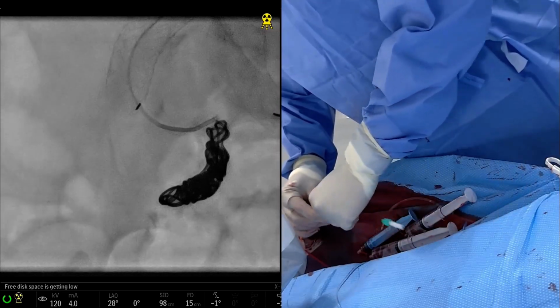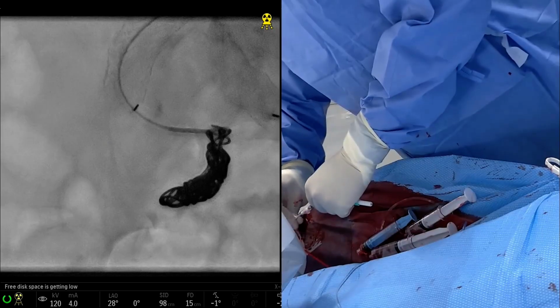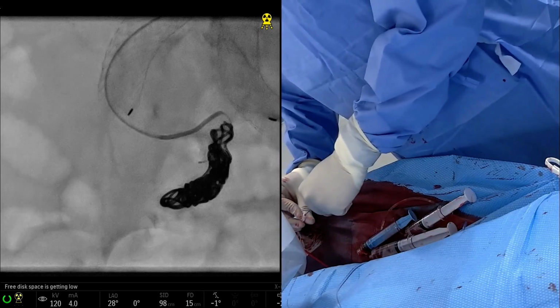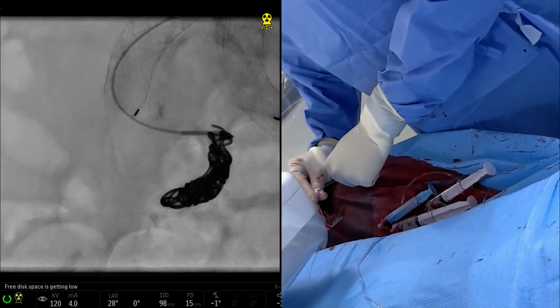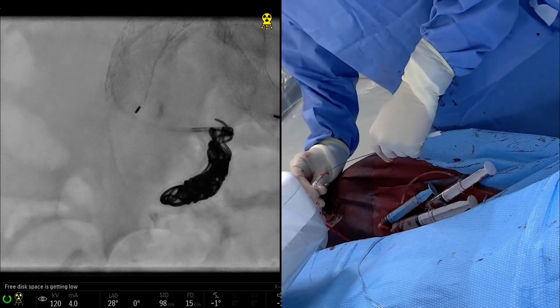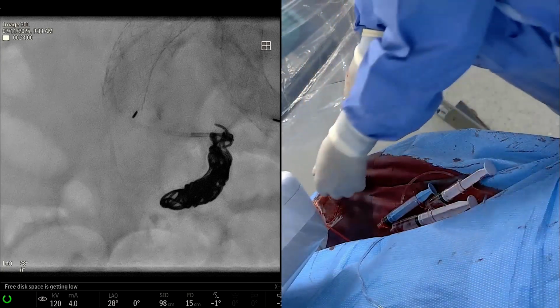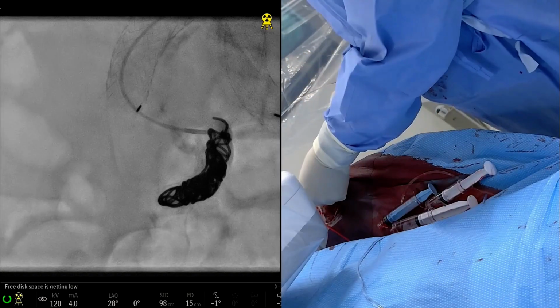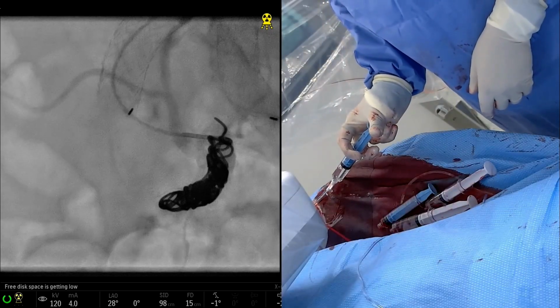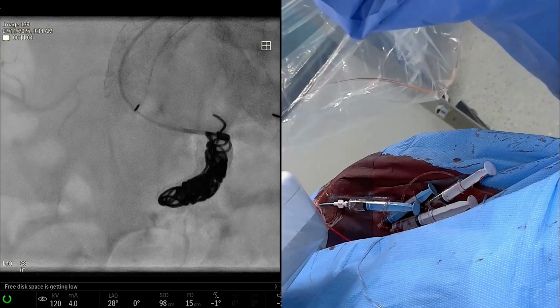Yeah, I think we could. I think we have enough space to put another 30 centimeter packing coil. You can see how the coils are bobbing, so you see the inflow. I haven't used this coil, so I'm kind of excited to see. Oh yeah, see there's that branch that's going up, right? That superior sacral branch. But I think if we just put another packing coil, it should cover it.